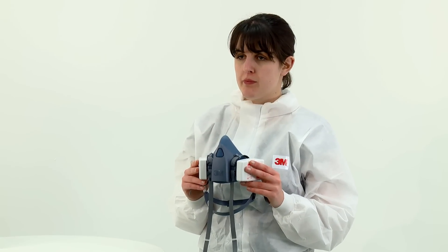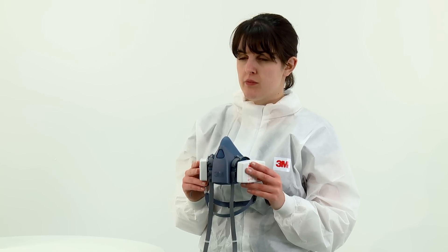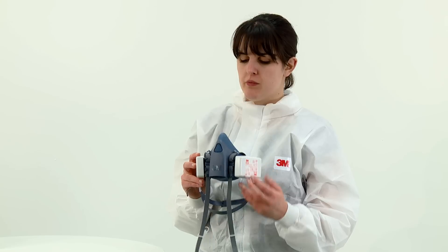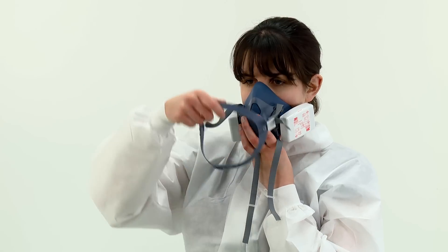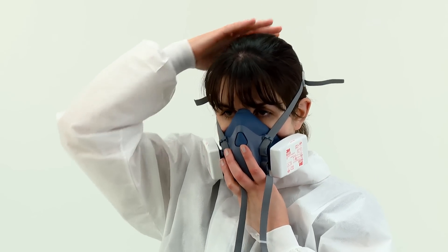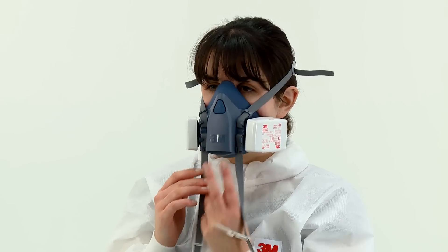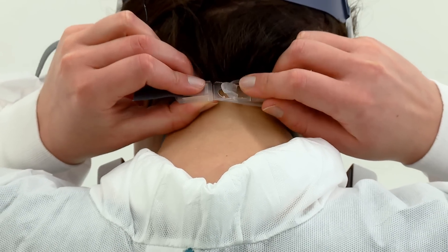The method of fitting the respirator to the face is the same regardless of which filters have been fitted until you reach the fit check. Place the respirator over your nose and mouth, fitting it comfortably on the bridge of your nose. Then pull the head harness over the crown of your head. Take the bottom straps in both hands and hook them together behind your neck.